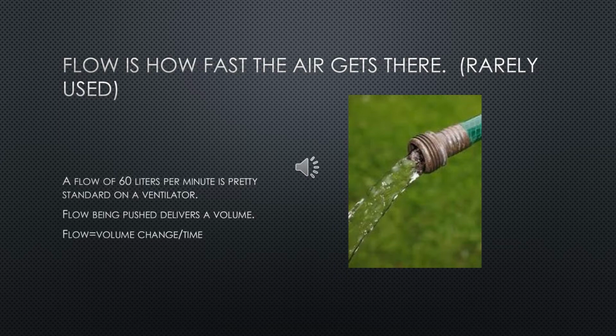So the flow is being pushed to deliver a volume. So if you think flow equals volume divided by time. So now think about this, the flow times I time will generate a volume. That's math.